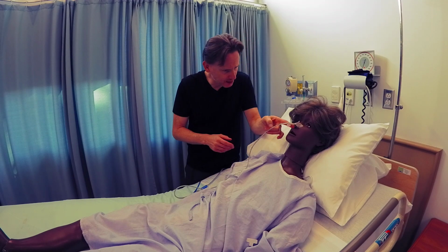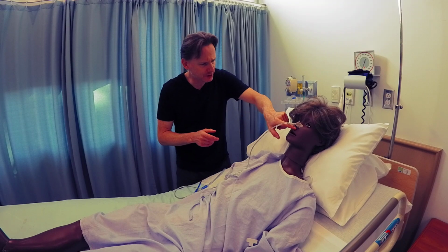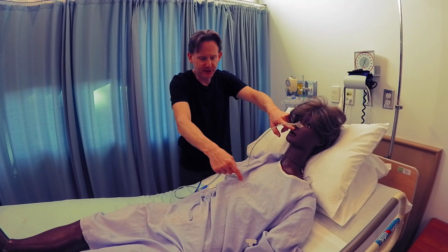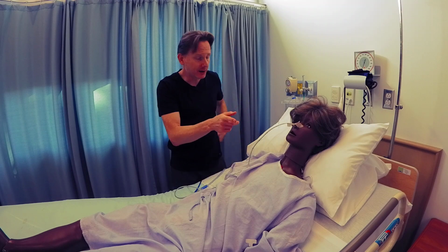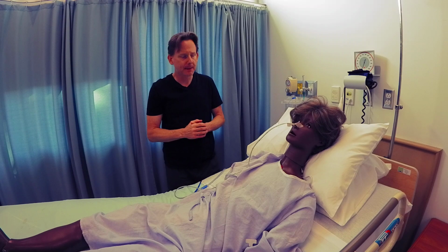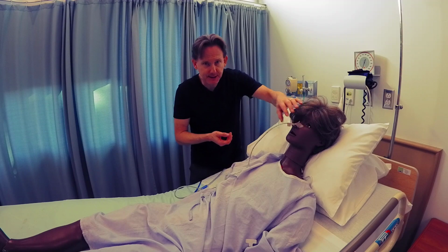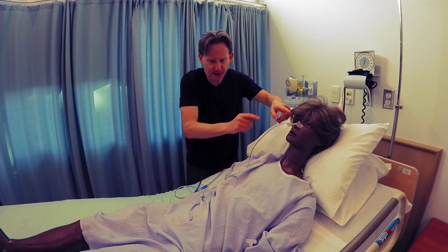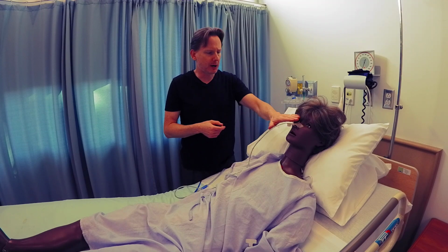Next, you're checking to see what is the internal length. The internal length is what goes from the entrance of the nostril down to the stomach where this tube is sitting, round about the xiphoid process area. And you're measuring that by simply looking at the number that you can best see near the entrance site of the nostril. Sometimes that's covered by tape, so you have to do your best to approximate what that number is. The person who inserted the tube should easily get the number because they've done the measurements. They'll get the number, and that should be what you're seeing. But again, sometimes it's blocked by the tape.